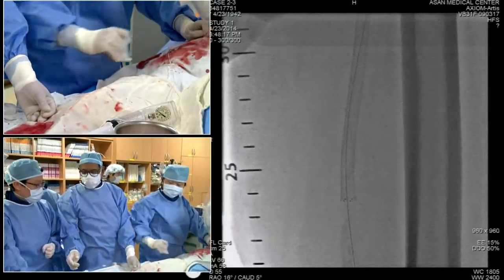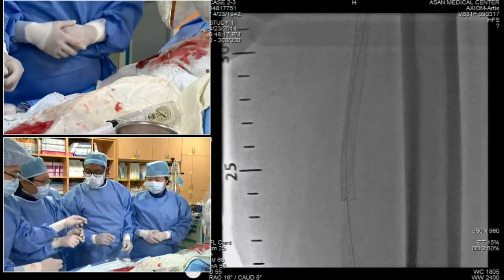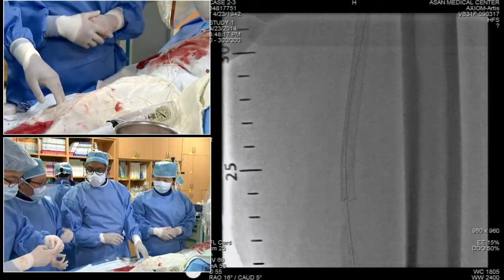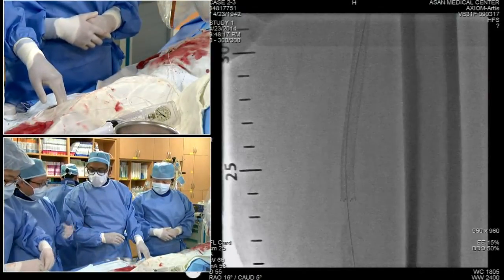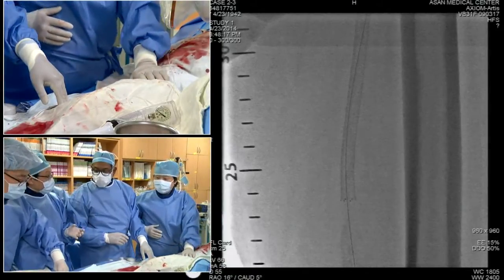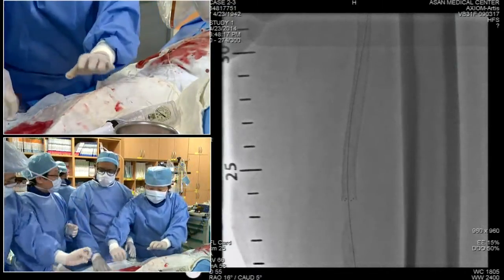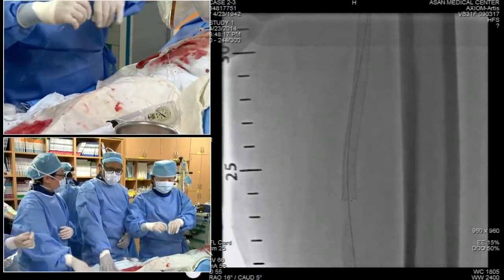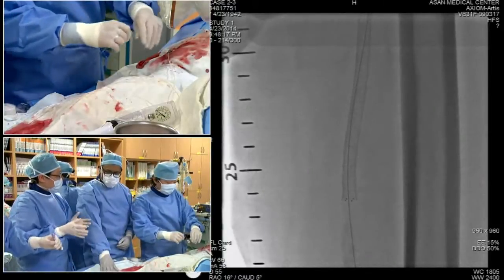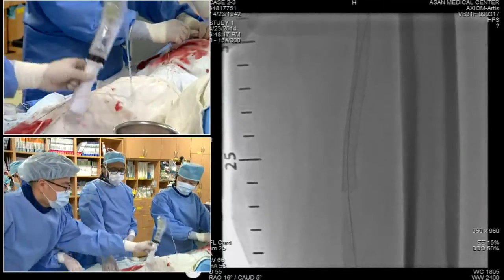This is a drug-eluting balloon is available. So we previously thought that the drug-eluting balloon was not available, so we tried to do the angioplasty and then proceed with the stenting. But now we know that we have the drug-eluting balloon. So we can do the drug-eluting balloon for the intraluminal in-stent lesion, and then we can do stenting for the entry site.